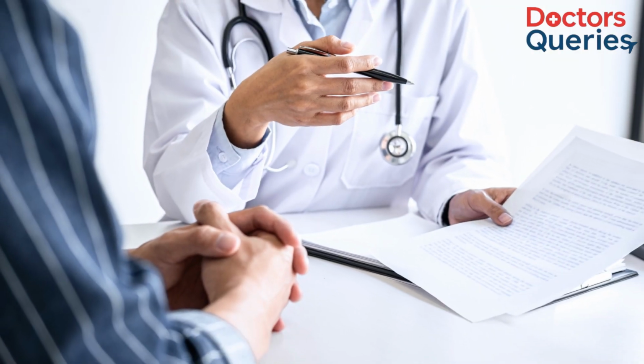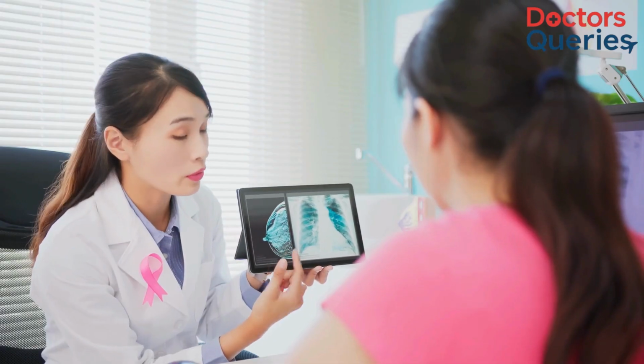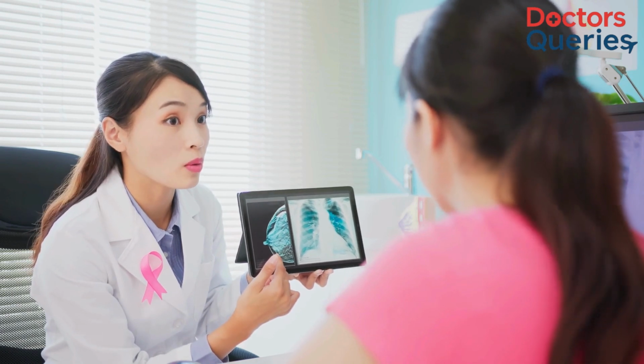So when a patient comes for radiation treatment, it is done in steps. The first step is counseling the patient. We sit with the patient, read all the papers which the patient has, understand the disease of the patient, understand the biology of the tumor, understand all the scans, the MRI, the PET scans, the CT scans, and also the histopathology of the patient. And we need to also examine the patient well. And once the patient has been studied well and the disease has been understood well, then the radiation planning begins.